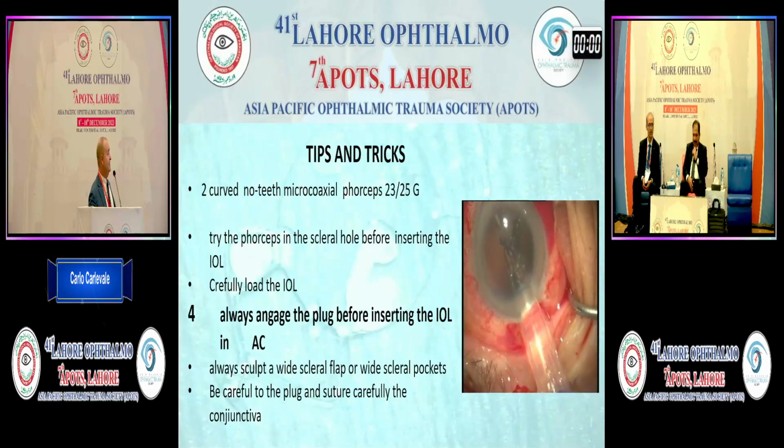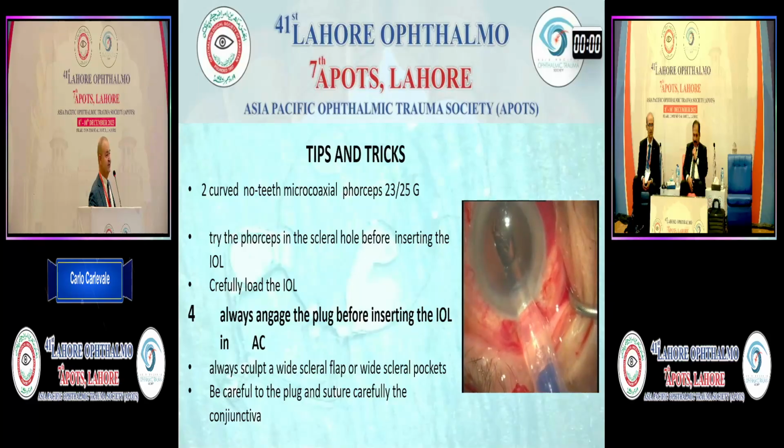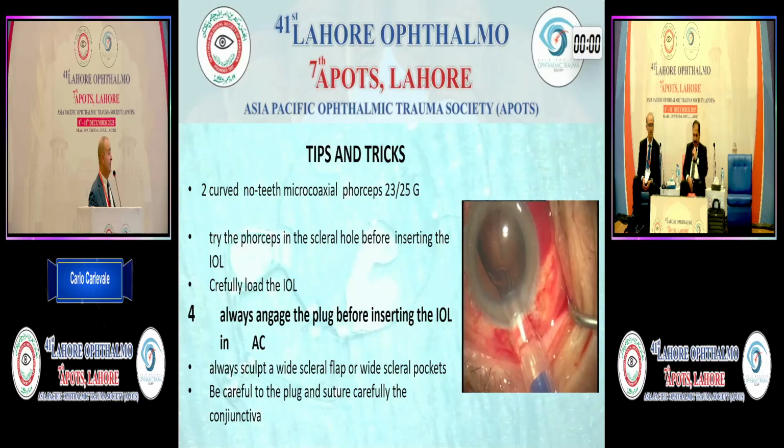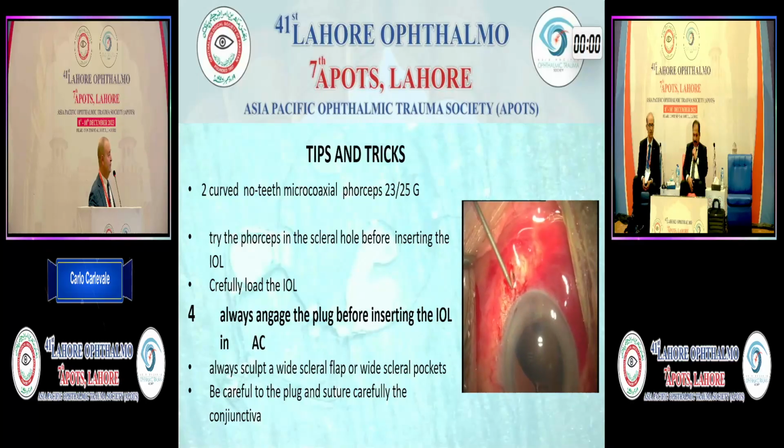Always engage the plug before inserting the IOL in the anterior chamber, because especially in the fully vitrectomized eye, you may drop the lens down in the vitreous. So it's mandatory to be careful during that step of the procedure.